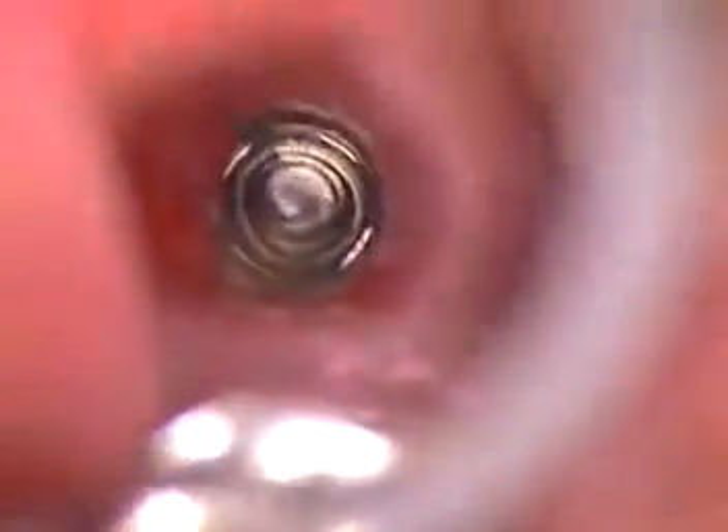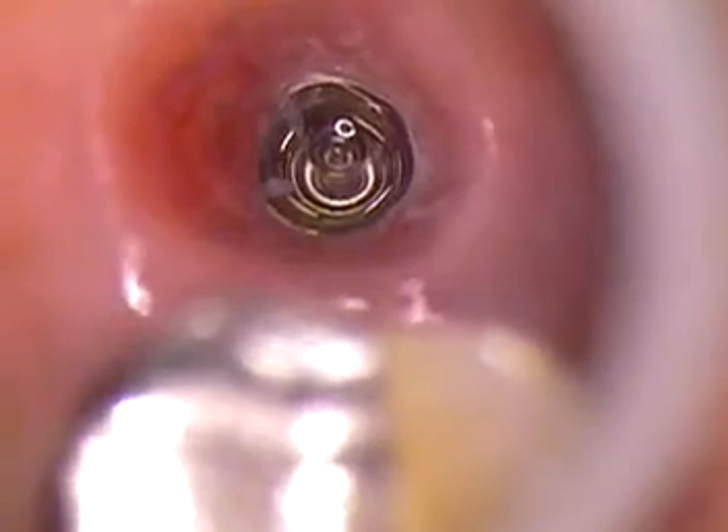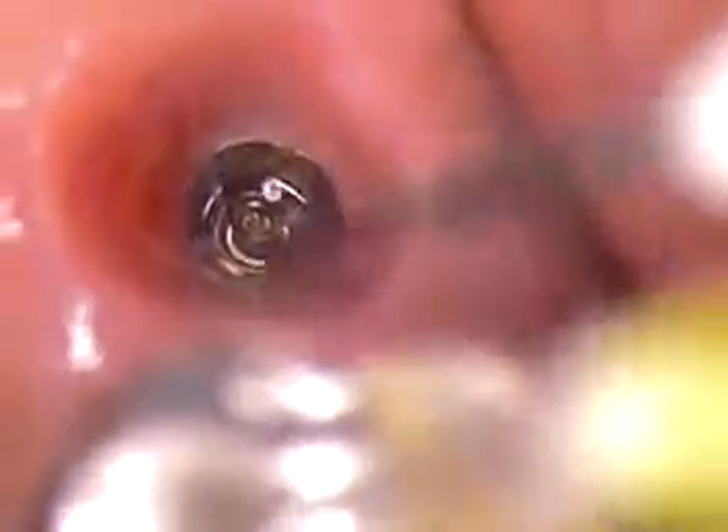We're going to let that soak in there, then take a micro brush next and go ahead and take care of that. I'll put a small micro brush right down in there, agitate it a little bit so that you can clean out. Then we rinse that thoroughly and suction that out. I don't like to blow a lot of air in there — I just get it scrubbed, get it rinsed, and then suction with the micro suction tip.